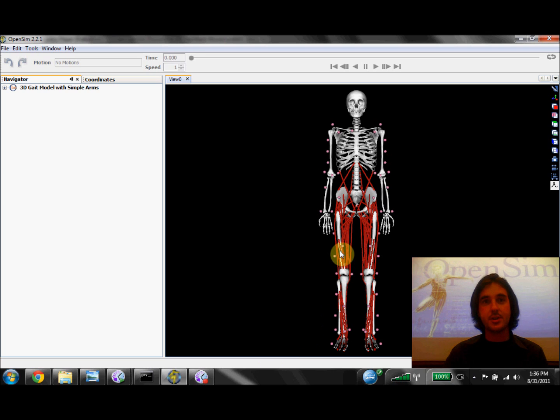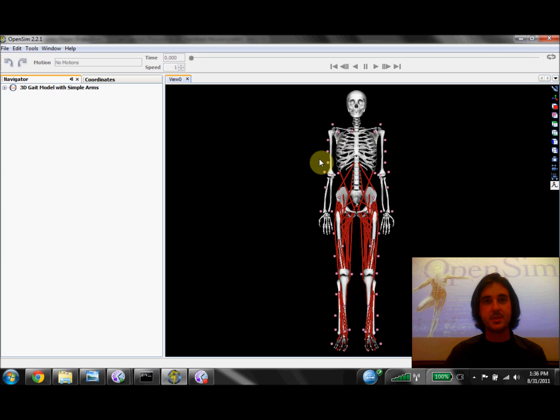So I've already loaded a generic musculoskeletal model into OpenSim, and you'll notice it has some pink markers around it which represent a virtual marker set I've created based on the marker set we used during our experiments.